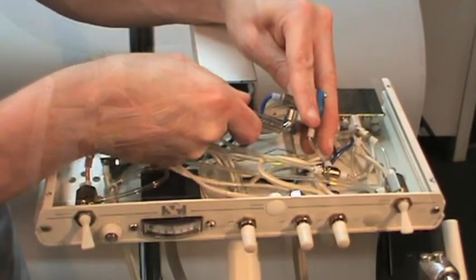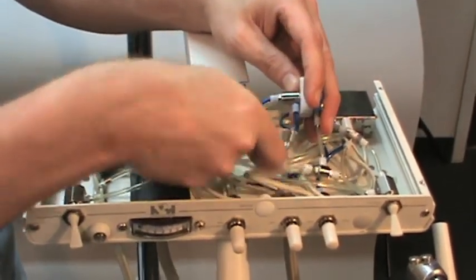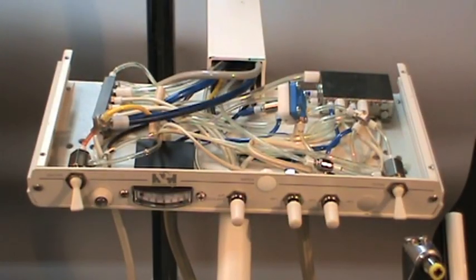After all the lines are reattached and the unit has been checked for proper function, take pride in the fact that you have just stopped your leak.